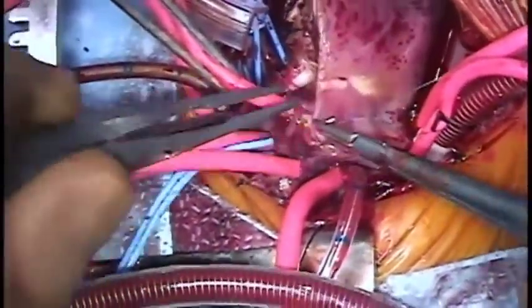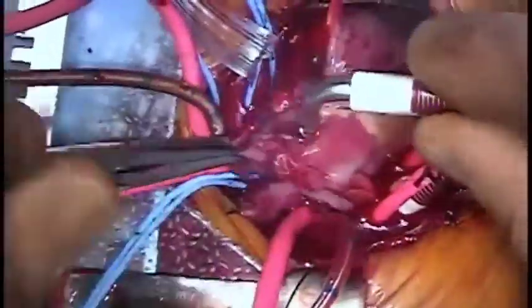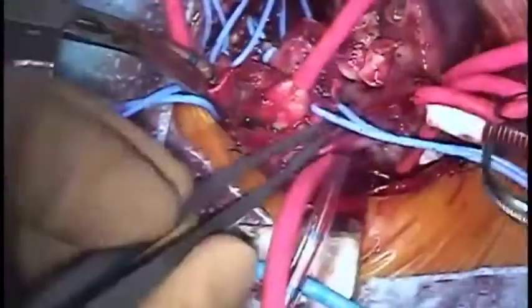The cannula is then replaced in the right atrial appendage and the second layer of over and over sutures is completed. By keeping the suture line under tension, the atrium is held sufficiently closed to allow bypass to resume.